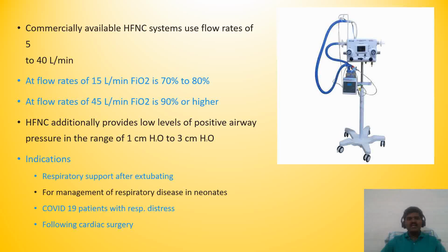Indications: respiratory support after extubation, especially in neonates, for management of respiratory diseases in neonates, COVID-19 patients with respiratory distress where immediate intubation is not required, and patients following cardiac surgery. HFNC is proven to prevent invasive ventilation.